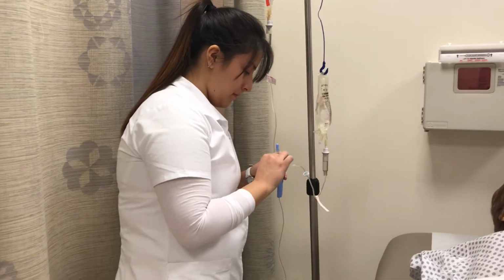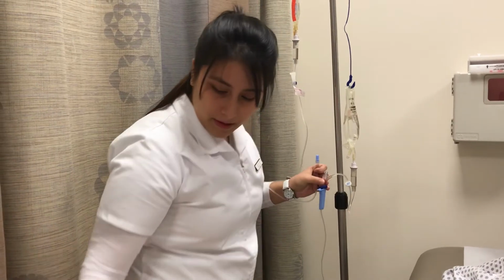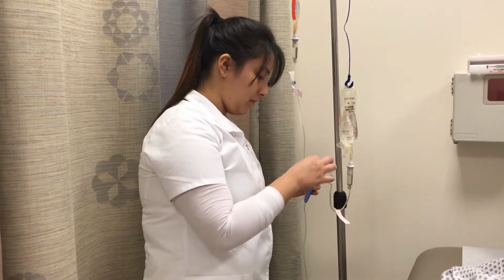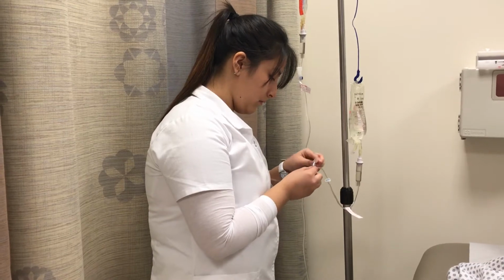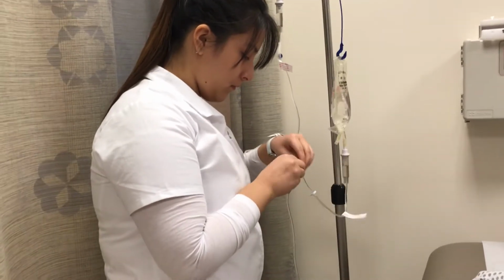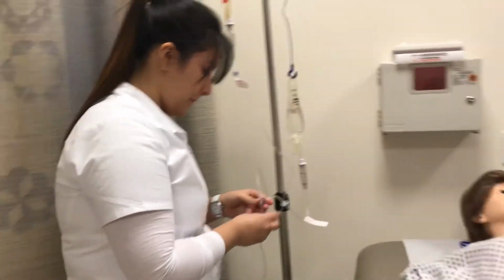So I'm going to start with my 7 steps. Check physician's orders. Okay, it's been 15 seconds. Gather my equipment. Introduce myself. Identify the patient. Explain what we're going to do. And provide privacy. So first I'm going to make sure the patient is comfortable.